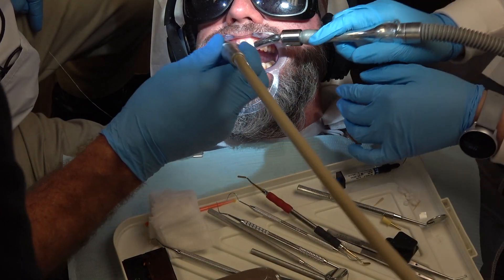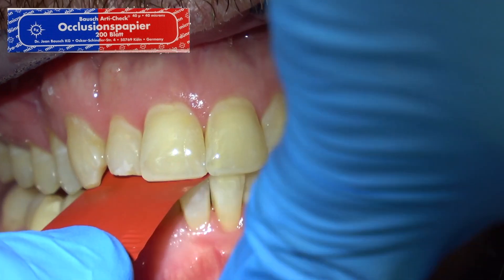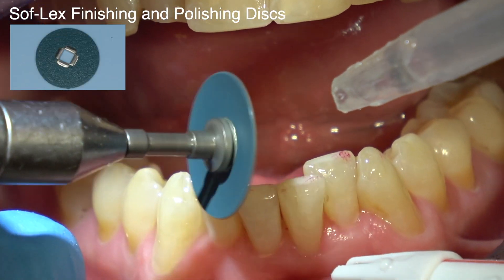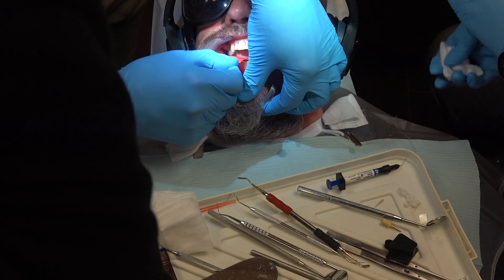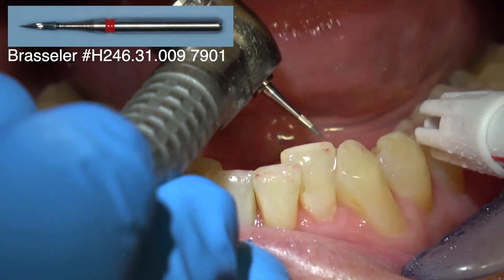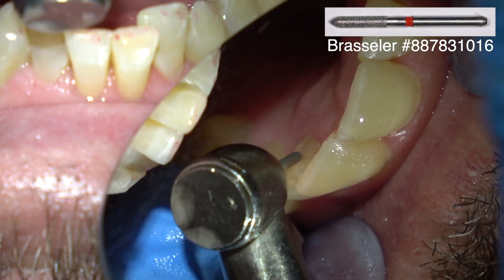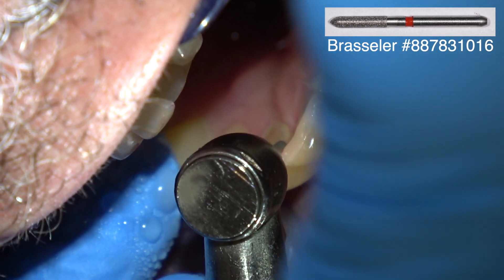Once you finish polishing, check his occlusion. Bite on your back teeth, please — tap, tap. Bite on your back teeth again. Remember, you never want the four anterior teeth to contact before the cuspid, the bicuspids, and the mesial of the first molar. You always want to be able to pull shim stock through the four anterior teeth and the second molar — having anterior contact first can create a TMJ problem.